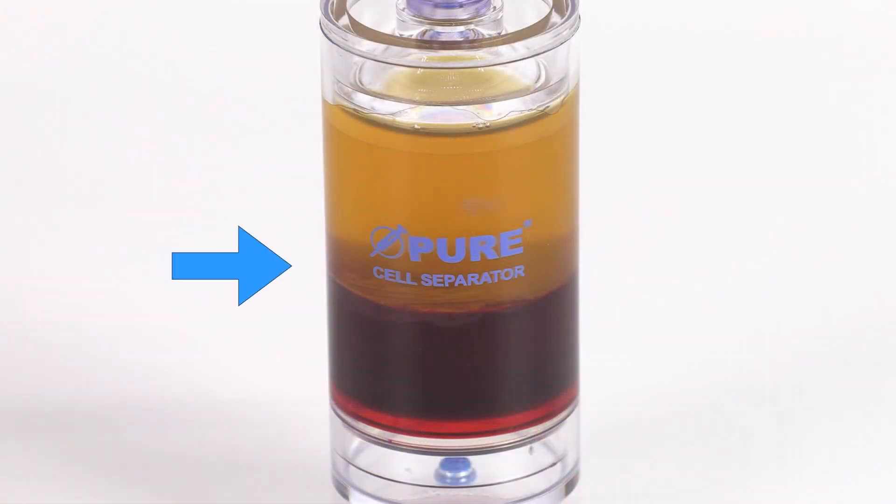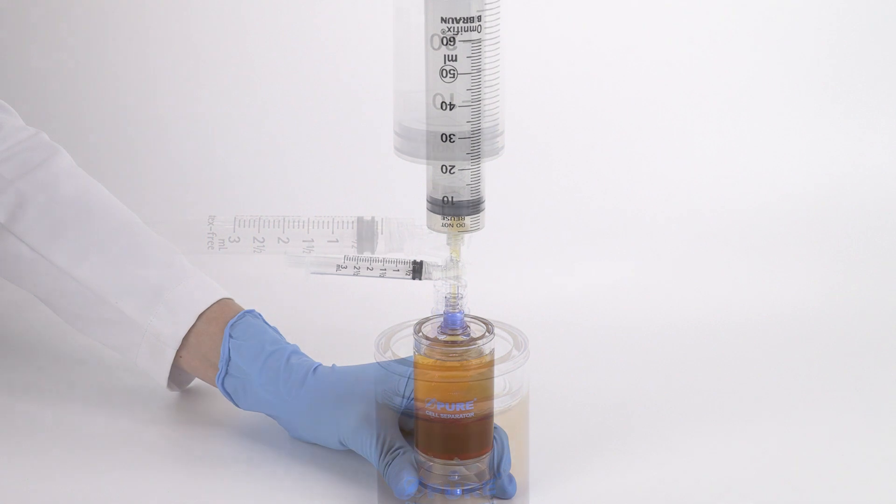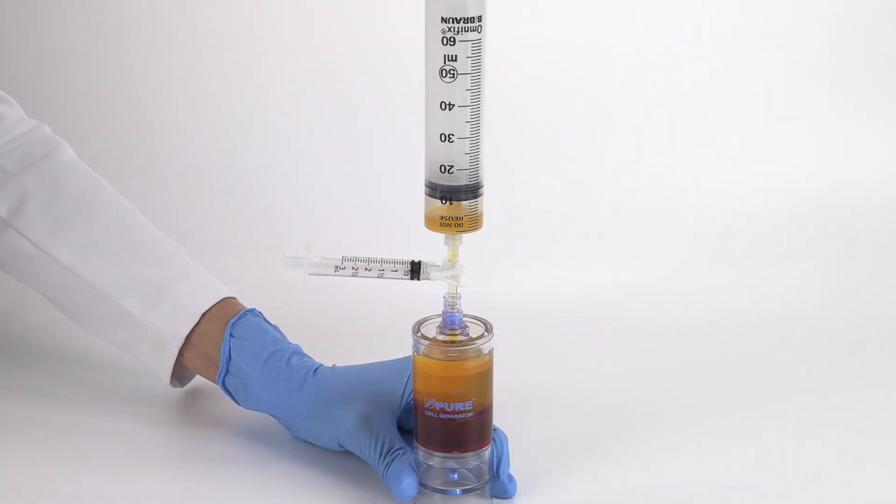Close the centrifuge lid and press start. After centrifugation, the bone marrow buffy coat layer will be clearly visible. Attach the sterile syringe accessory to the needleless port and aspirate the bone marrow plasma suspension.